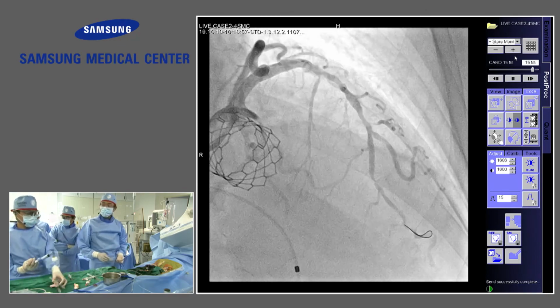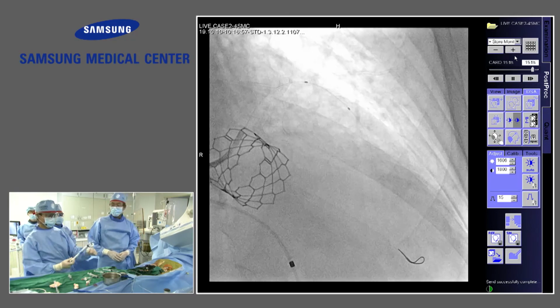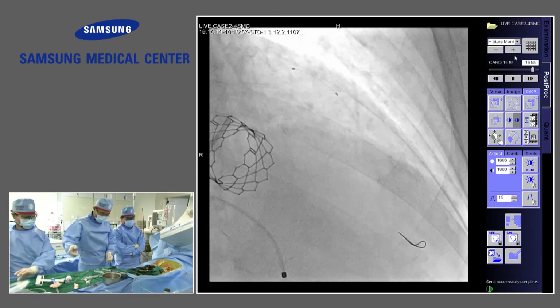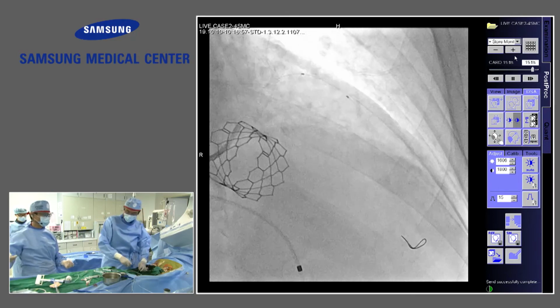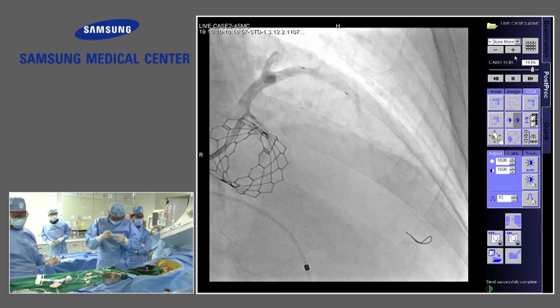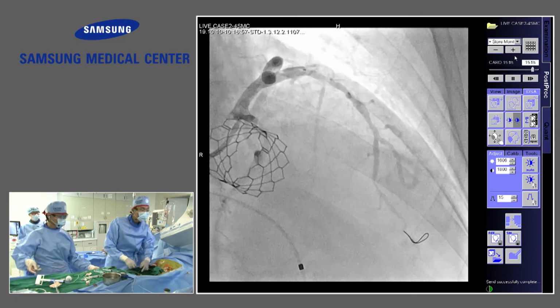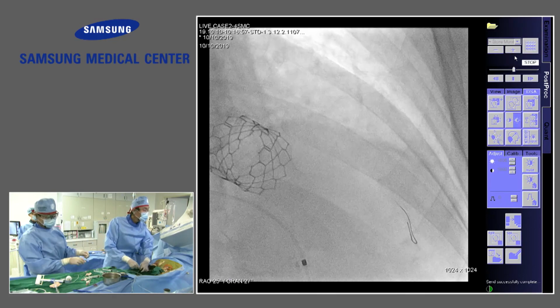So you can leave us now. I'm very ashamed and I'm very shy and I don't like to show you the PTCA here. We are curious about the post-stenting FFR. It'll still be abnormal because there's some distal disease as well. So I don't know whether you're planning to balloon it, or leave it alone. Maybe you are interested in the FFR after stenting? No, I'm saying it will still be abnormal, Dr. Gwon, because there's still distal disease in the LAD.